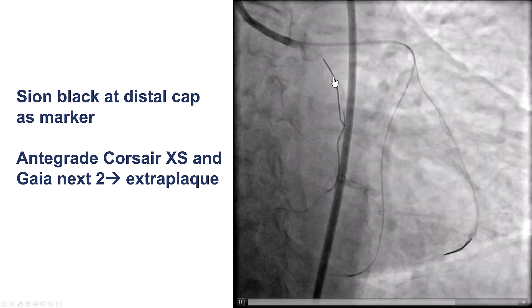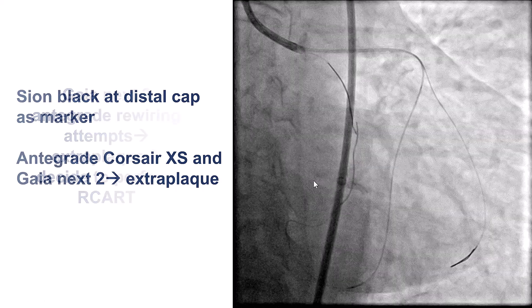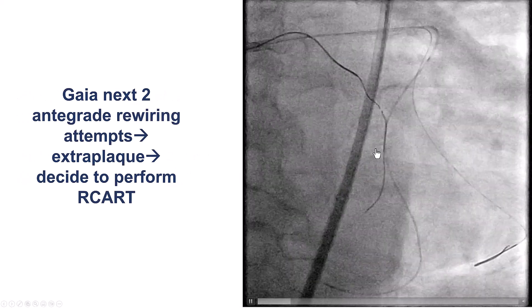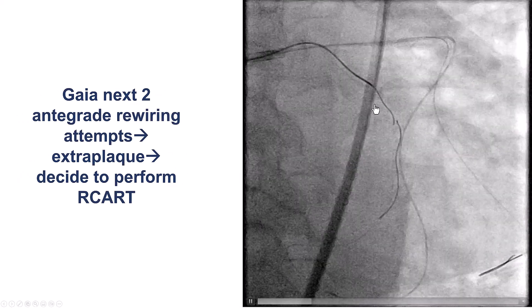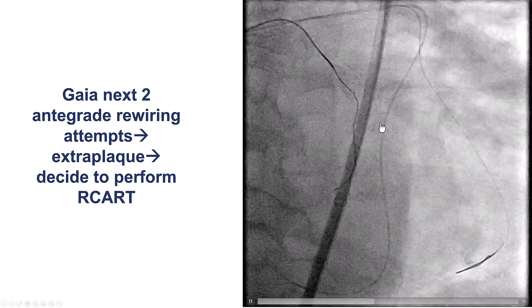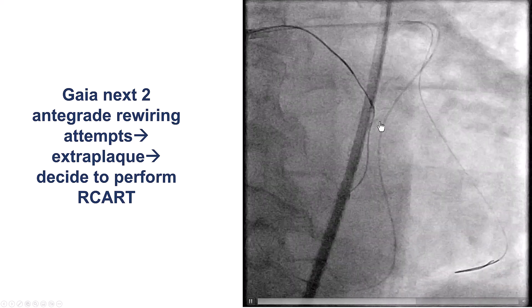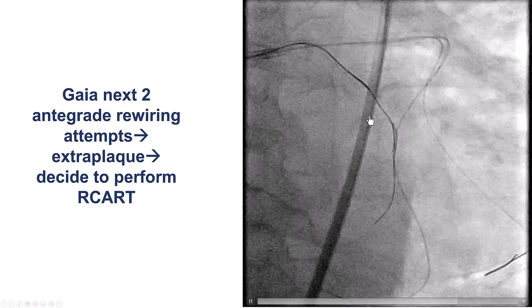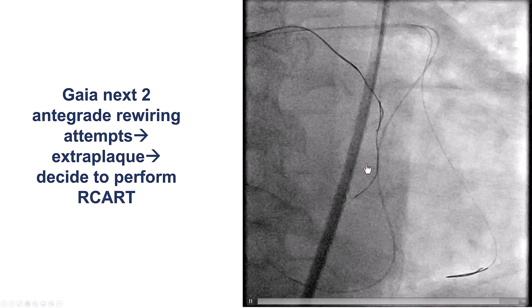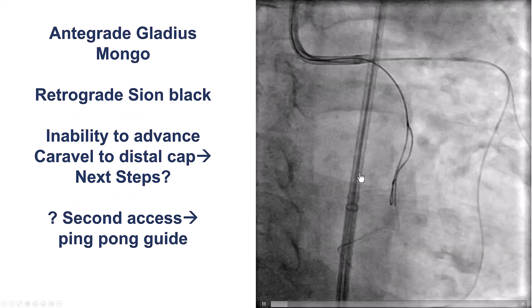We tried to cross with a Corsair XS and a Gaian X2, but that appeared to be going extraluminal. More attempts were made to advance the guide wire further down, and although the guide wires were close to each other, the antegrade guide wire remained in the extraluminal space.